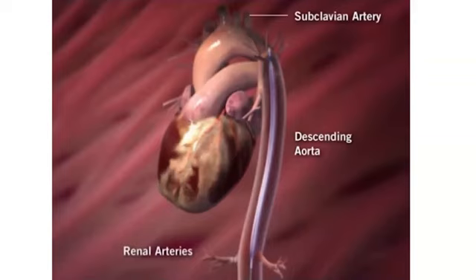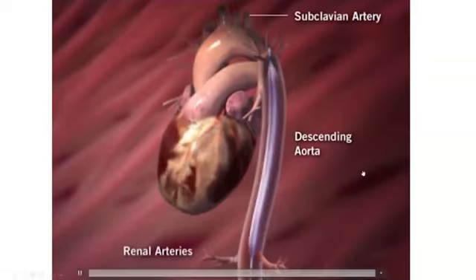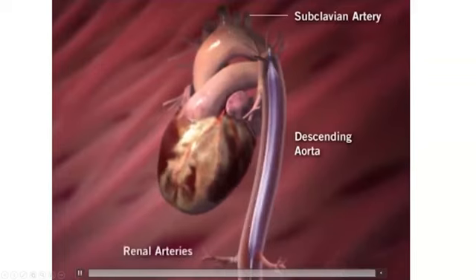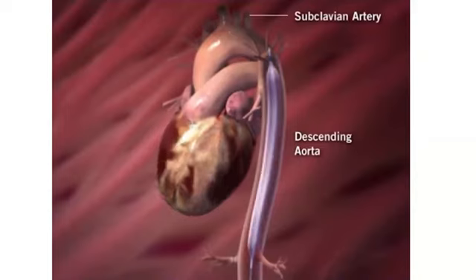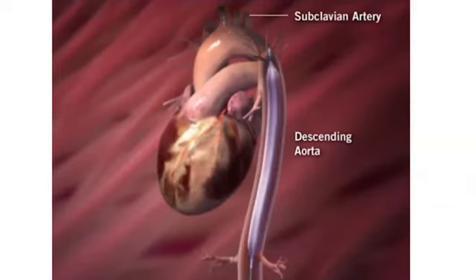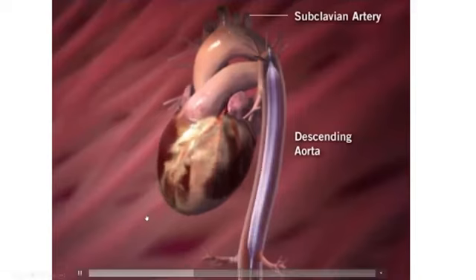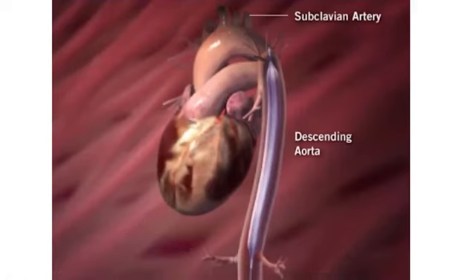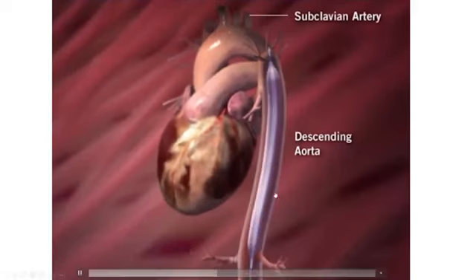Now, inflation can be done every cardiac cycle, the so-called one-to-one mode, as you can see in this image, but it can also be done every second or third cycle, the so-called one-to-two or one-to-three modes. The one-to-two and one-to-three modes are not very supportive and should not be used routinely. They are only valuable for weaning and for adjustment of inflation timing.